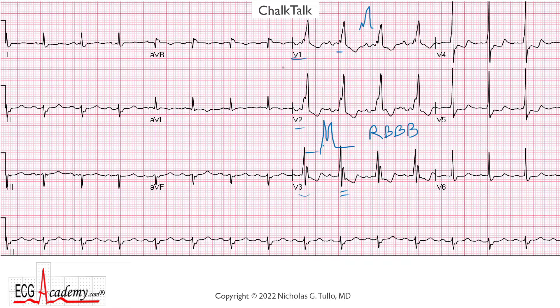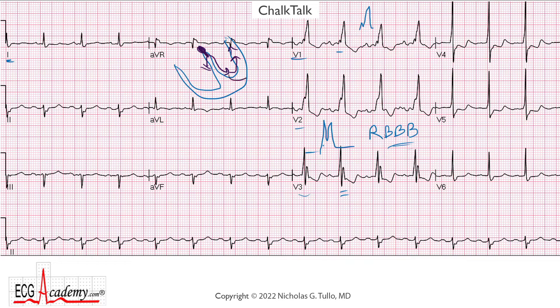Along with the rabbit ears, or RSR' in V1, V2, V3, in a right bundle branch block you expect to see a wide S-wave in the lateral leads. In a right bundle branch block, the AV node passes the signal down to the HIS bundle, and the right bundle is not working. So the signal has to go down the left bundle, activate the left ventricle normally, but then the right ventricle has to depolarize very slowly through intramyocardial cell-to-cell connections. You get this late signal headed towards the right side, away from the lateral leads — one, AVL, V5, and V6. That's why you get this negative deflection, this S-wave, and it's a little wide because it's taking a long time to get around the right ventricle.